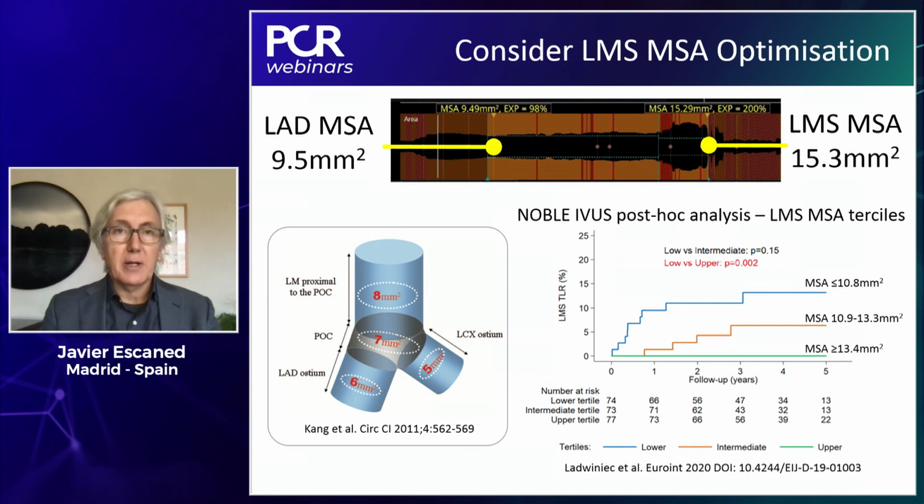You will not do that if you have the suspicion that your wire could be behind the stent, for example. But he knew that, he could overcome this small resistance by using this maneuver. So congratulations. I think it's a great case and illustrates, again, the control that this imaging during PCI gives to the operator.